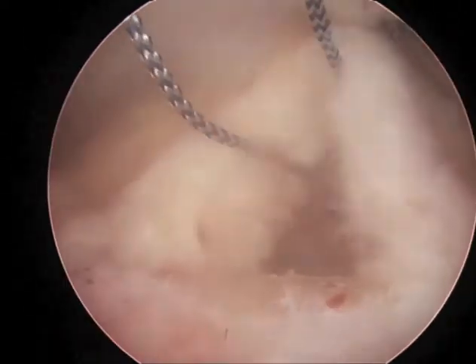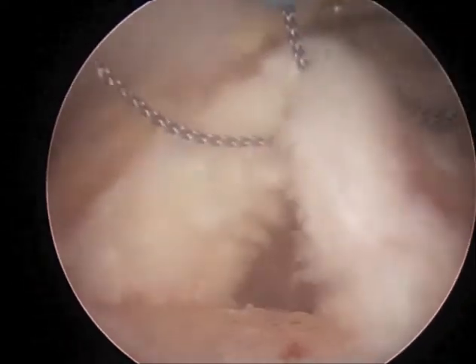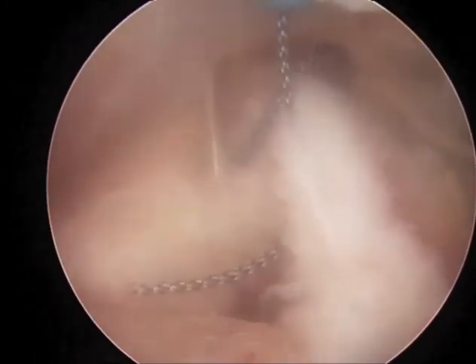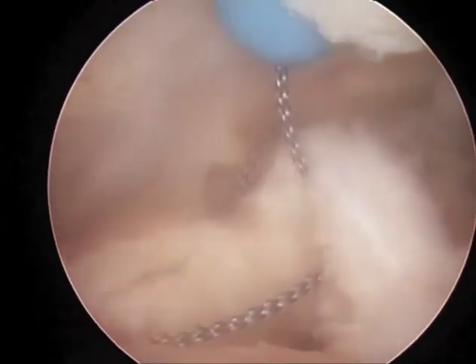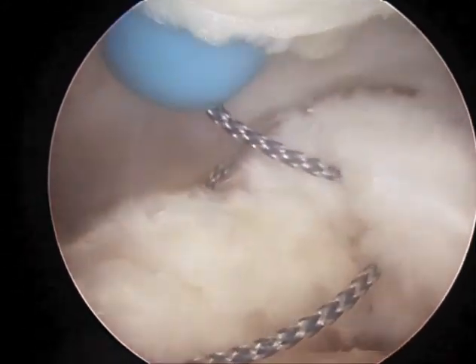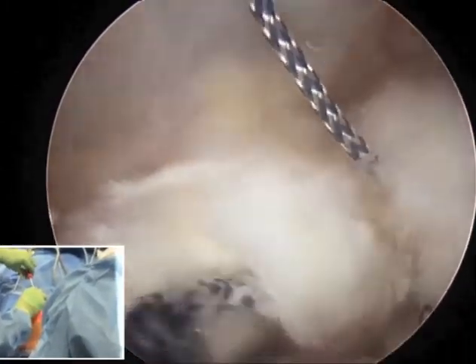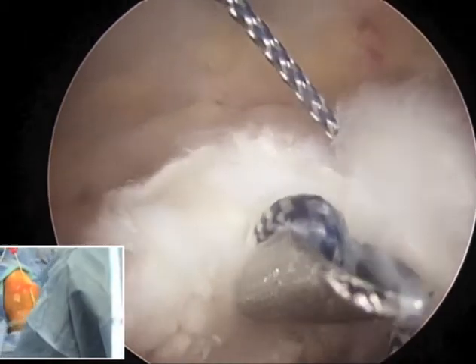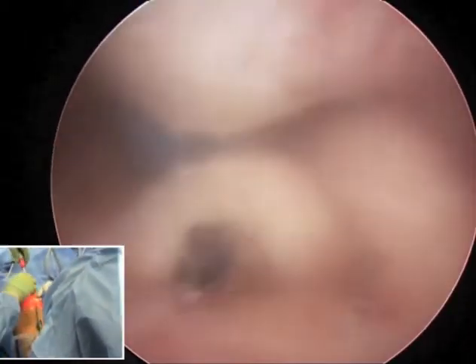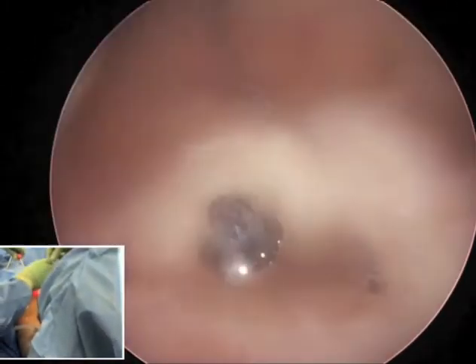We'll pull that back out the superior posterior portal, then bring the edge of the suture back through the central part of the triceps tendon. The goal is to make a Bunnell-type suture, and as we bring this back to the tendon you can see we're staying fairly central. We'll hand this off to our retriever and pull that back out our more distal posterior central portal.